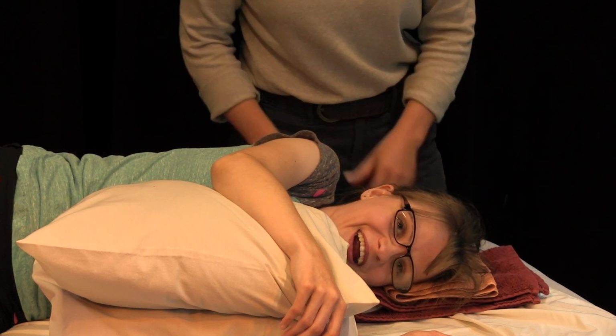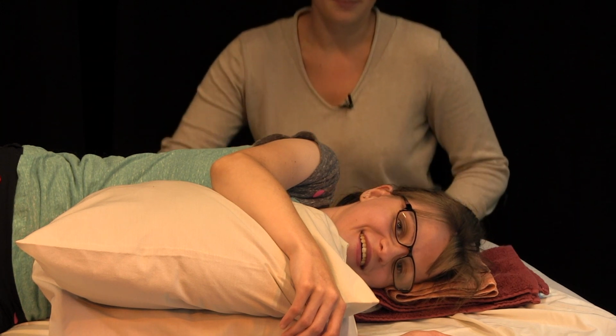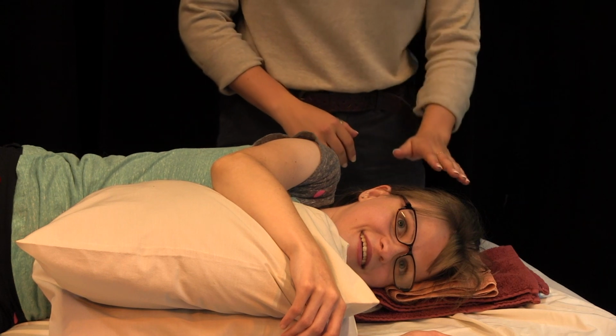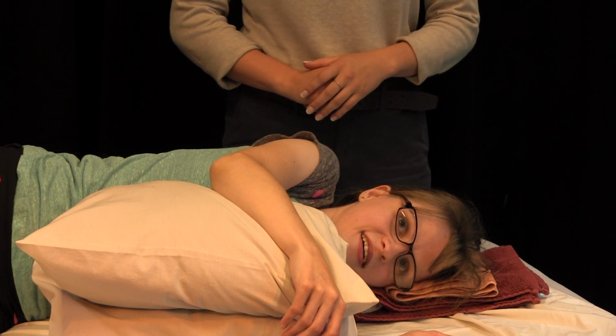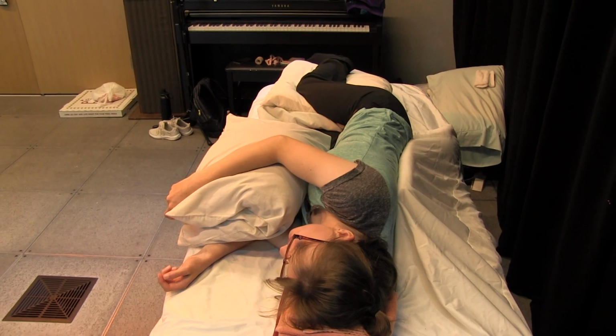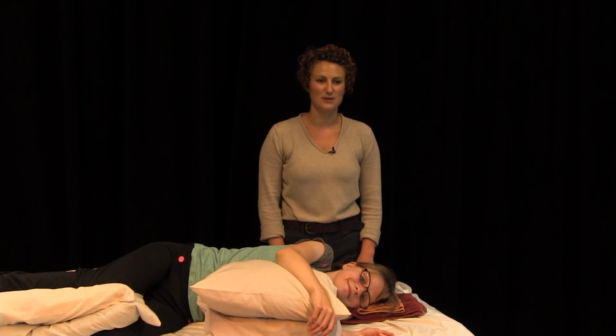Much better. Okay, and so you can again check the user's spine, making sure that the neck is aligned with the spine and that the head is supported and not tilting off to one side or the other too much. When these postural supports have been placed, remember to check in with the user's comfort. As the user's body begins to get used to this PCM system, adjustments will need to occur over time.